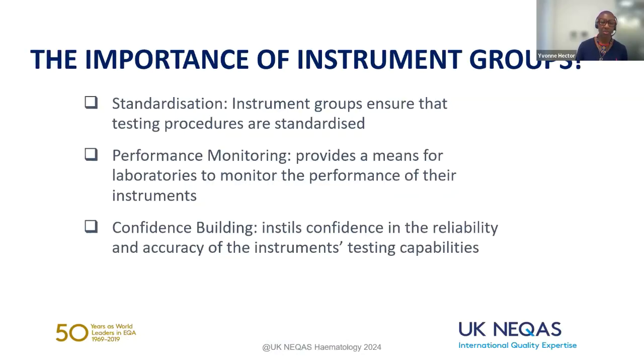And it also gives confidence building. Being part of an instrument group does instill confidence in the reliability and accuracy of instruments and their testing abilities. So overall, instrument groups are essential for ensuring the reliability, accuracy and credibility of lab testing processes.